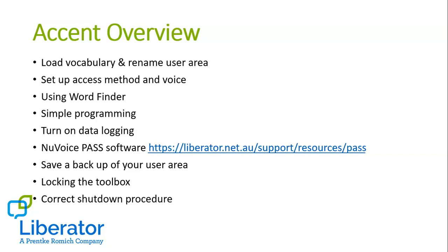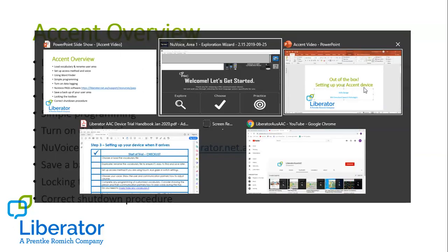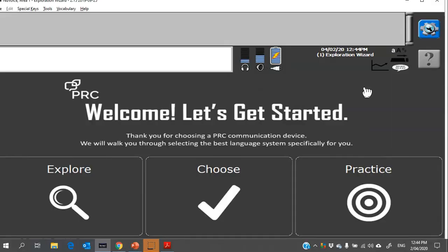Okay, so I'll just flip over now to my software. I'll be using the NuVoice PASS software on my computer today, but it looks the same as the software that you will have on the device itself. So once you turn the device on, you will need to choose and load the vocabulary that you're planning to use. If you're not sure which vocabulary you should be using, please don't hesitate to contact us.